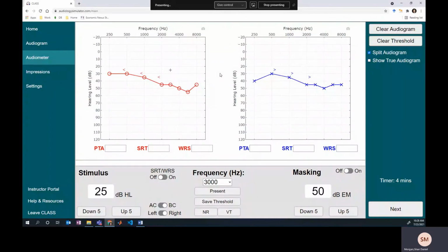There's this interesting conductive piece going on right now. There's a lot of discussion on what symbol you should use to mark it, because if you just save it in both thresholds, does that mean that you really found it in both ears? That's kind of misleading to say that you found the threshold in both ears when you only really had the oscillator on one side. So should you use an upside down bracket? Should you use an upside down arrow? What symbol should be used to mark testing in both sides? That's a topic for debate, and I'm happy to hear your comments in the comments down below.